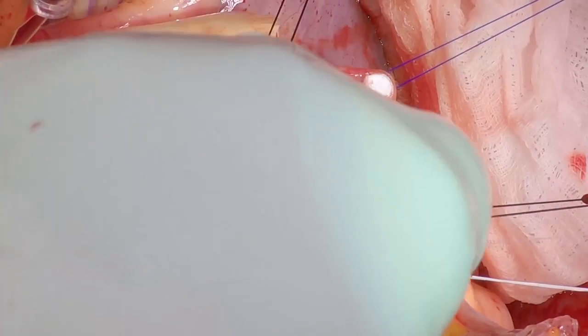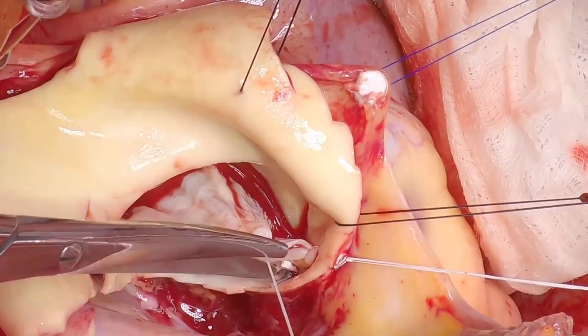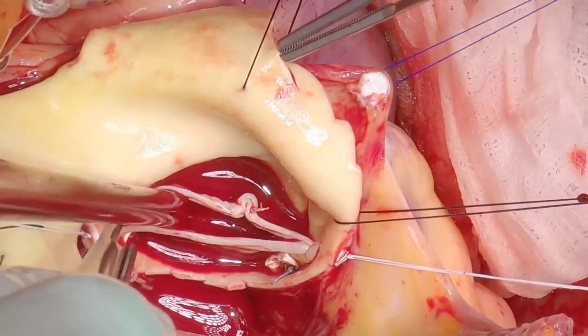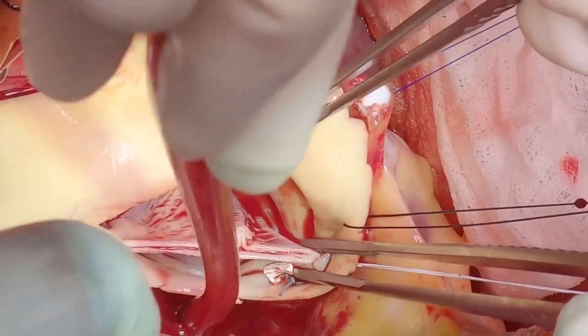This suture is Ethibond, not a Gore-Tex suture. The plication is now complete and there is good symmetry to the leaflets.